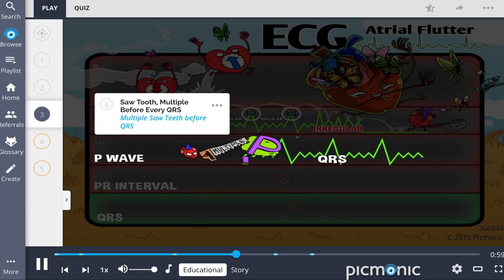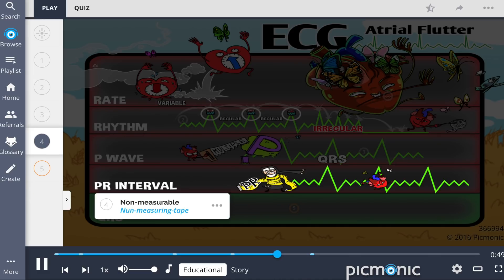The presence of multiple P waves before every QRS creates a sawtooth-shaped pattern, shown by the multiple saw teeth before the QRS complex. Due to this sawtooth formation, the PR interval is non-measurable, shown by the non-measuring tape.